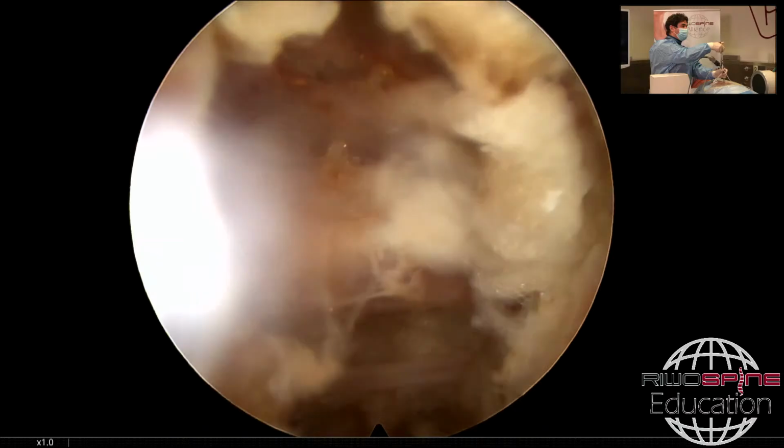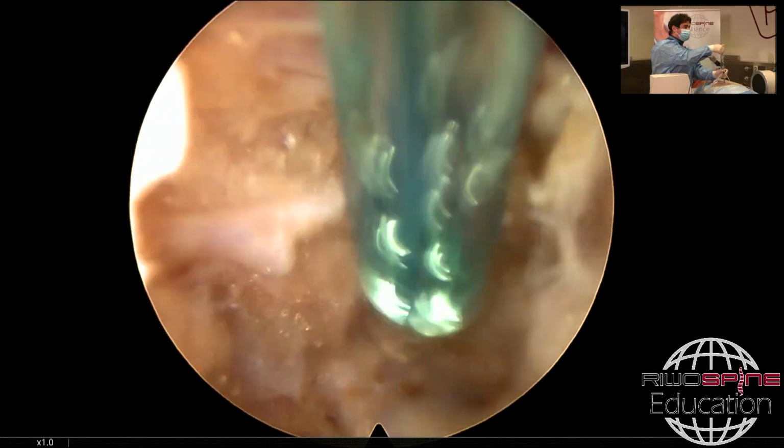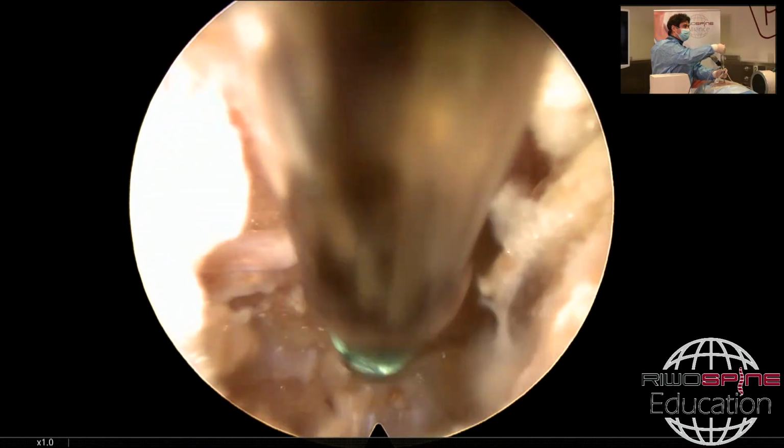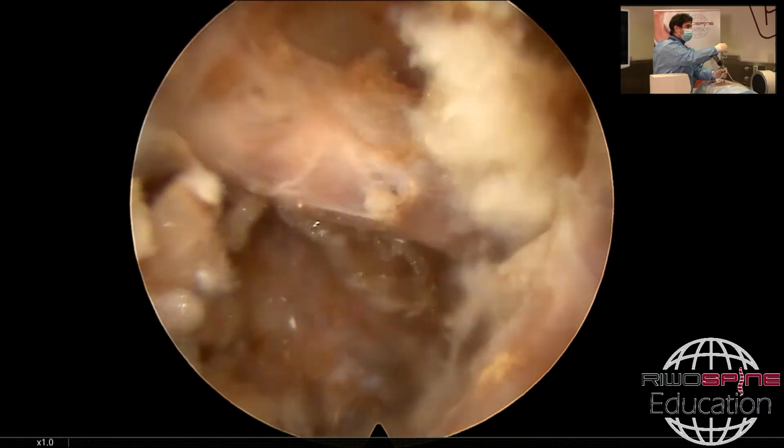Okay, now what we see, it looks like neural structures, and these are the vessels located in the recess. I just coagulate them in advance, not to have a problem later.